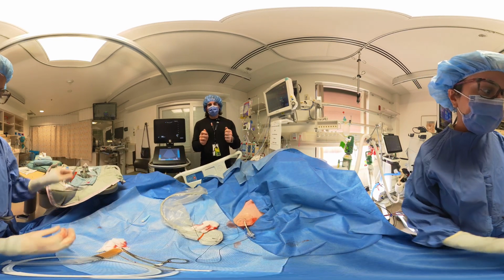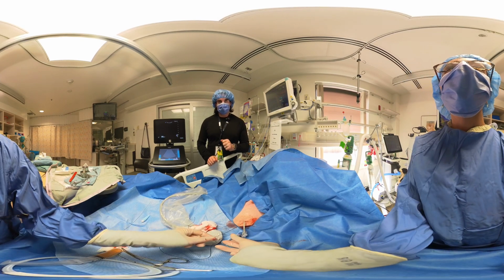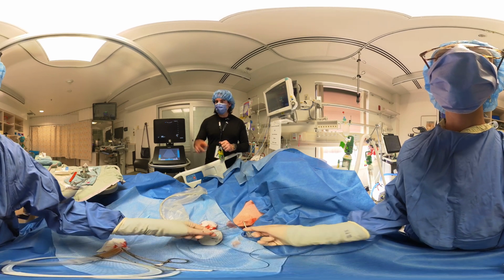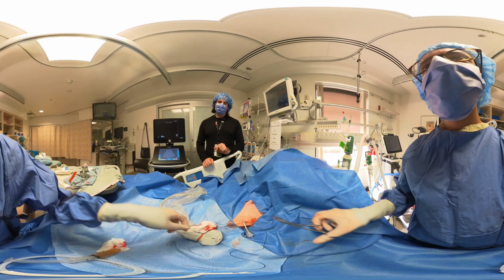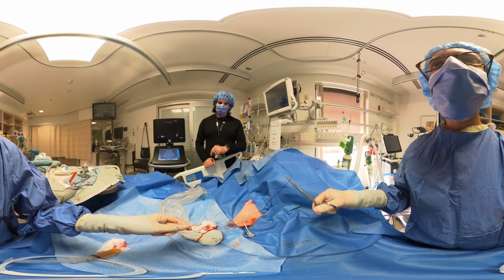At this point in time, we're going to throw down a couple knots just to the skin. Okay, great. Yeah. I'm really bad with the hand knotting. That's fine. That's fine. Yeah, go ahead. Yeah, it's all good. But if you ever want to talk about hand knots, I can show you how. So just regular knots? Yeah.